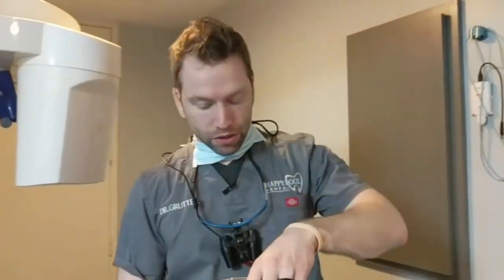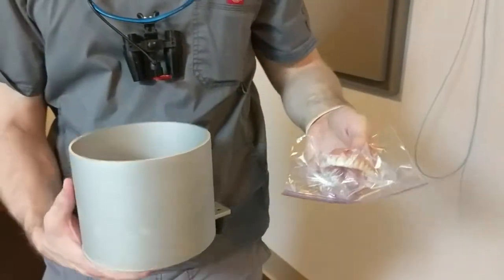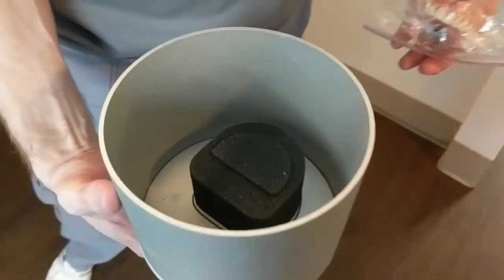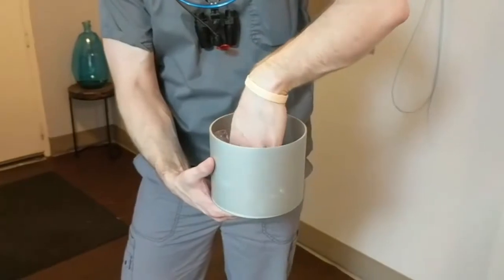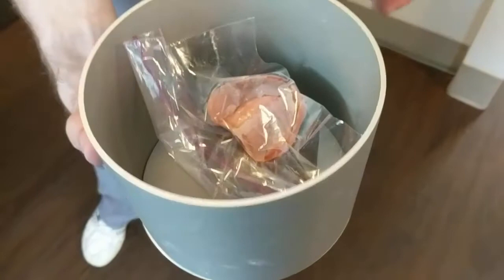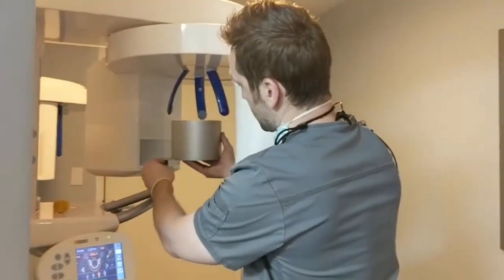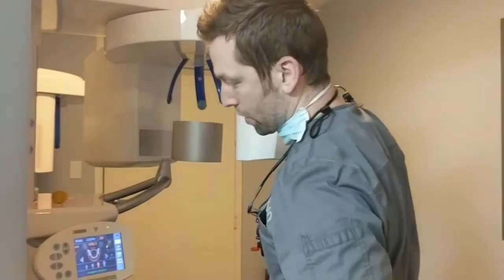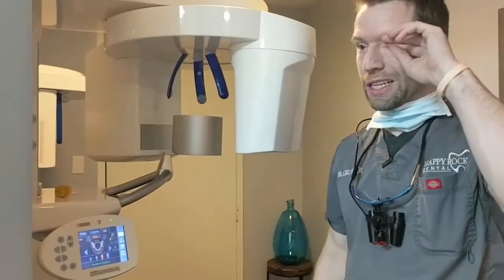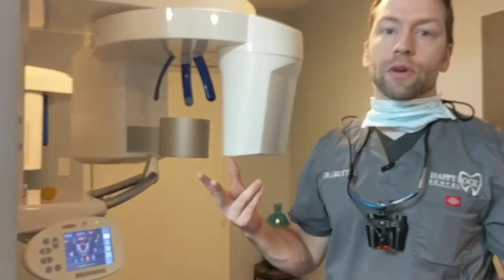We have now taken the denture out of Lucy's mouth. I put it in a baggie, simple enough, and then into this can that comes with — or rather that you have to order for — the Sirona machine. Different machines have different versions. The idea is the denture is now on a sponge, positioned at the right height for the scan. Take out the bite set, insert this. We usually just use regular adult size — you can adjust the size depending on your settings, but we have good luck with that. We take this scan, and now we'll have the two scans we need for a scan appliance guide.